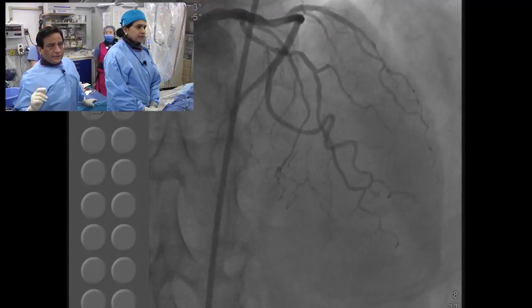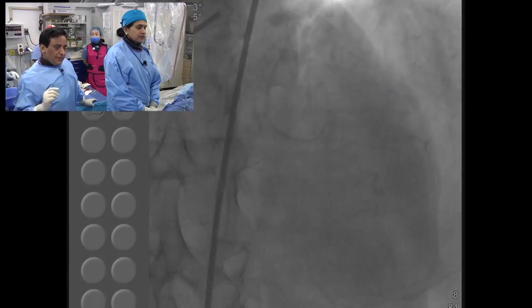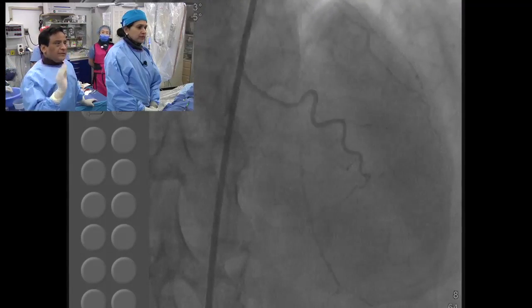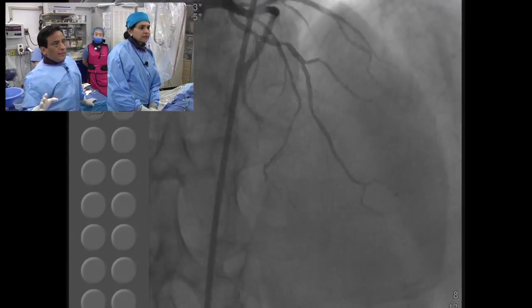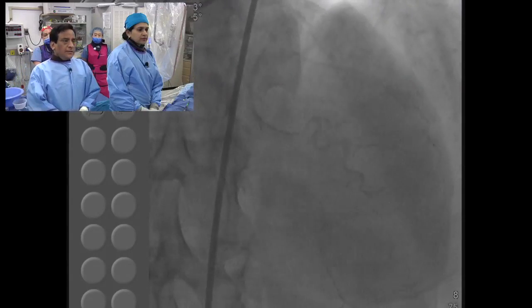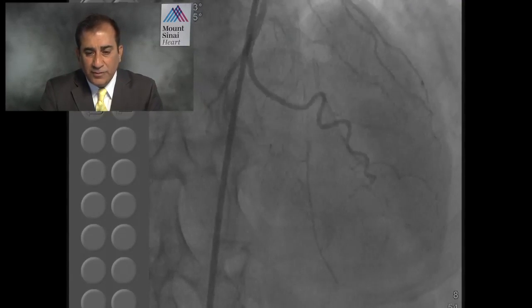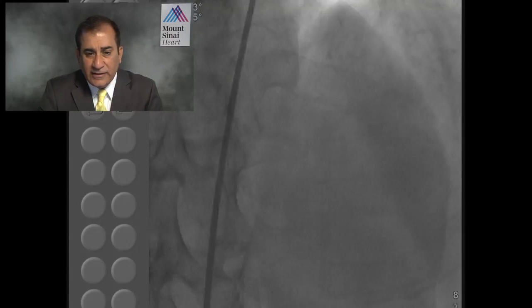Often our therapy is guided by whether the patient has non-invasive testing. This patient has a clearly apical LAD ischemia, and moderate and mild lateral ischemia, which I think was from the OM2, OM3, which has been fixed, and now the LAD. But yes, angiographically, the RCA has a lot of disease and could be suitable. It just gives you a little more room to work with the CTO of the LAD with the right open. But this is a wonderful case to demonstrate.